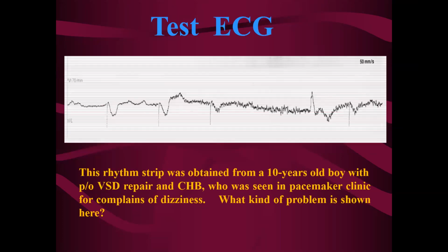Okay, final one. This should be a quick one. Just a quick pattern recognition. Pacing. The boy is complaining of dizziness, and we want to know why. And the nurse caught this strip. So the pacemaker is not pacing regularly. Aha. What do we call that?